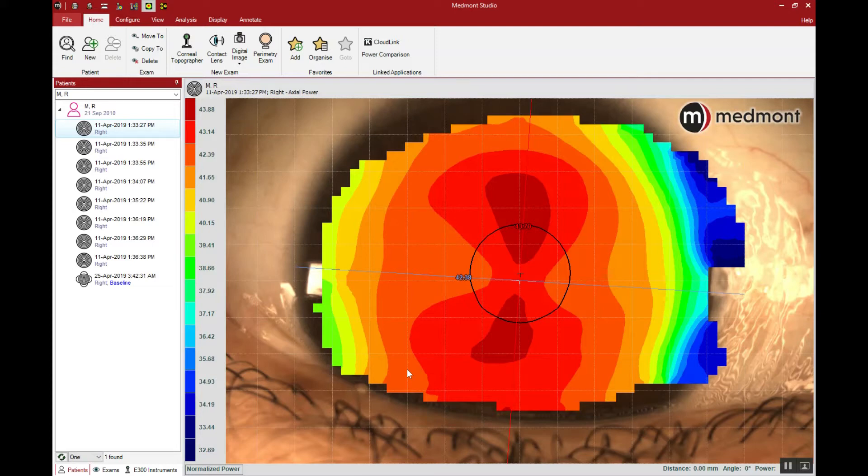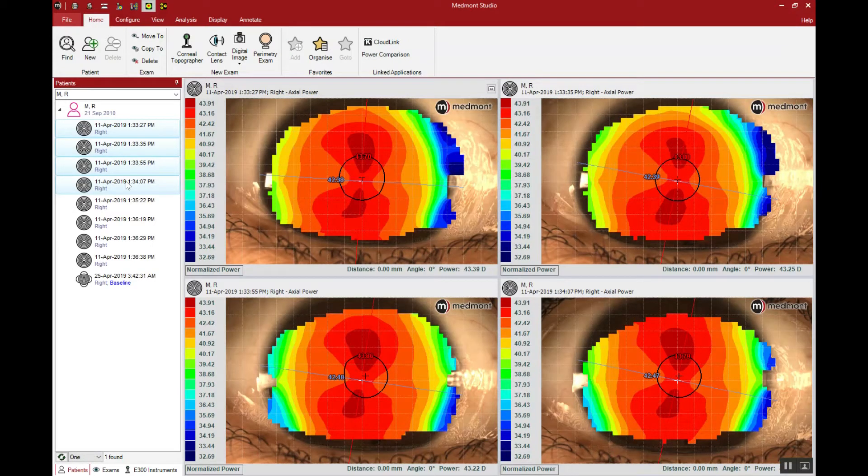When you have numerous maps to work from, you're able to say whether the topographies are reproducible. Did I capture the patient when the tear film was smooth and even? Did I capture multiple maps showing the same topography multiple times over? Here we can see our four baseline pre-orthokeratology topographies, and all four appear the same or similar — the central astigmatism is the same, and the flattening of the color contours from center to periphery all appear similar. These are very reproducible maps, giving us an accurate understanding of the eye shape.